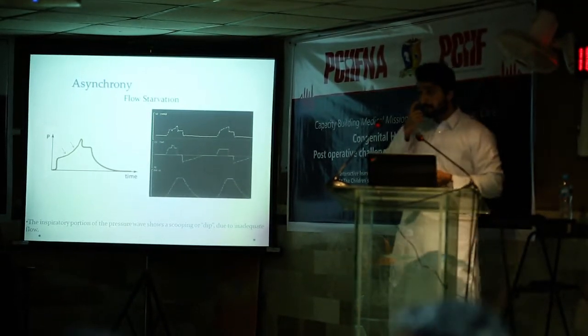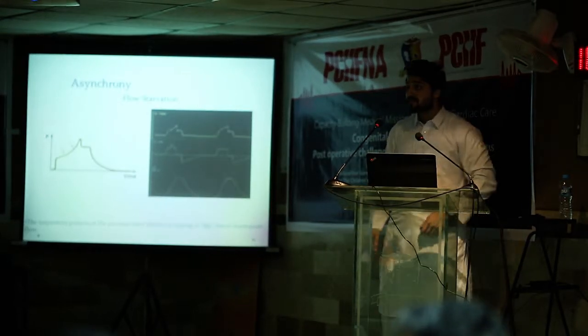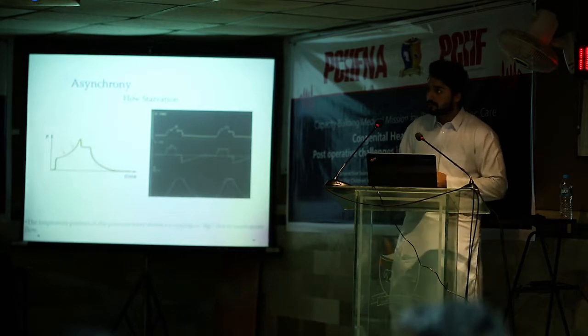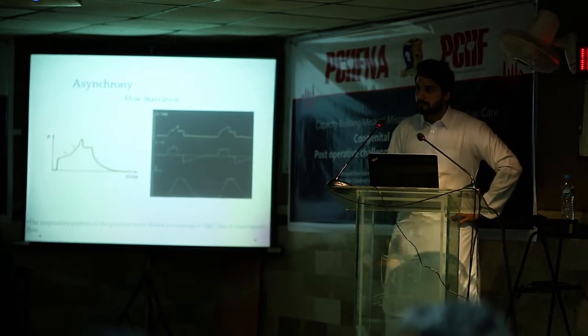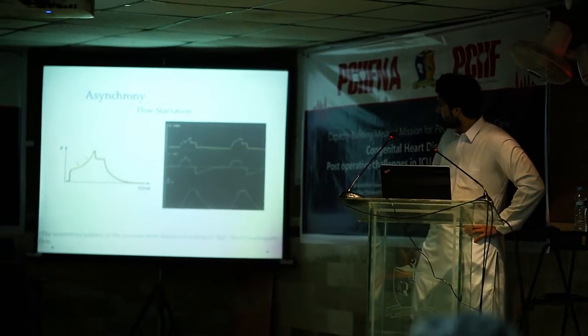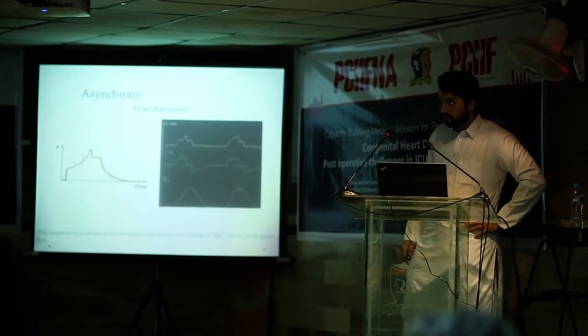Is this concept clear? Scooping, you know, when you take an ice cream cup, you scoop, it becomes a scooping. So same here: when you have a ventilator, usually you should have a normal rise. But now he's not having that rise, he's sucking the volume from the ventilator.